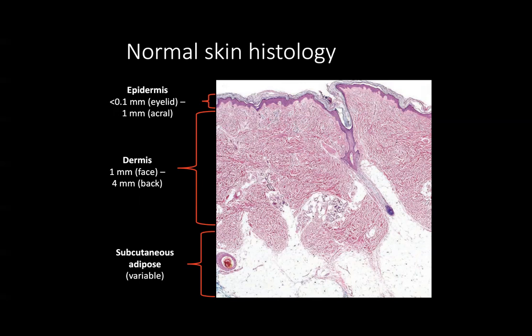And then subcutaneous adipose tissue. That's where you have most of your adipocytes, as well as the base of anagen hair follicles. You have larger vessels there. You've got some areas of the apocrine glands seated in the subcutaneous tissue as well.